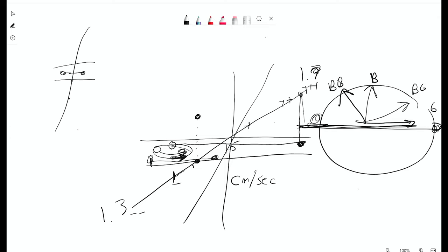Same reason, if we're looking at a vessel wall, we would need something. And I'm not a radiologist, you guys. There is probably a radiologist out there that is fine with this. But that's definitely not my scope, I'm just telling you that's the reason why people don't recommend looking into MRI for this.